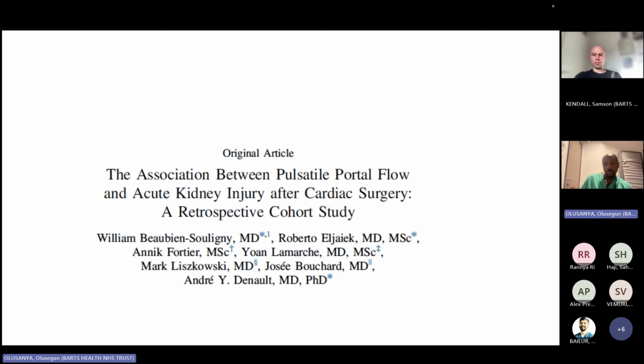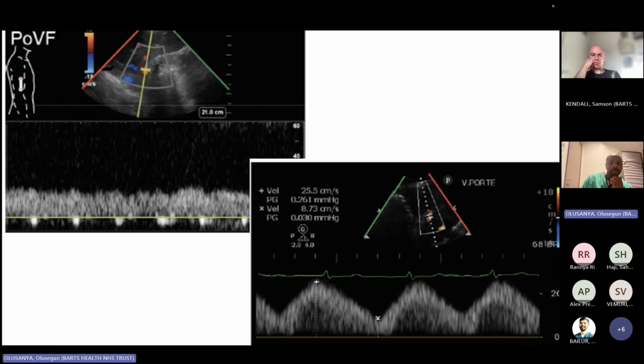But what he was doing is he was using IVC and portal venous flow and some of these ideas to diurese these patients, and was actually finding that if he diuresed them to normal portal venous flow, he was getting them symptom free for much longer, and they had actually outperformed their initial expectations of life expectancy and morbidity based on what the cardiologist had told them. So these two guys kind of came together and sat down, had a bit of a brainstorm, and put their ideas together with some of Ida's work.